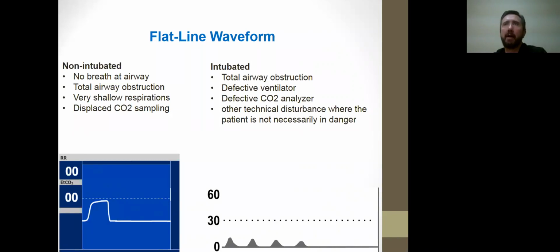So looking on the right-hand side of this slide, the picture on the right with only small, short-lived capnograms taking place, and the CO2 becomes immeasurable, more than likely this is esophageal intubation, okay? So this does not mean you are good to go. ET tube placement in the esophagus may be briefly detecting CO2 following a carbonated beverage ingestion when gastric distension was produced by mouth ventilation, God forbid anybody still does that. Residual CO2 will be washed out, though, after 6 positive breaths.